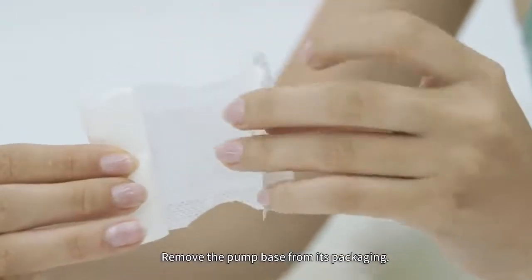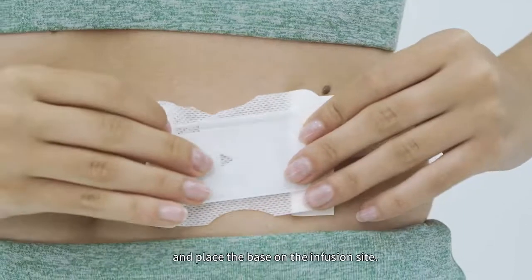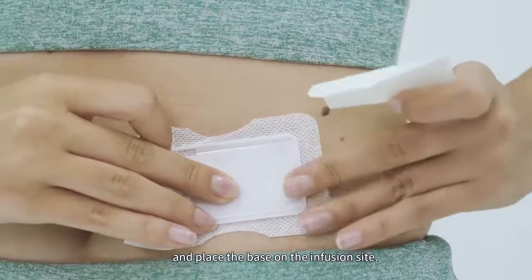Remove the pump base from its packaging. Remove the adhesive liner and place the base on the infusion site.